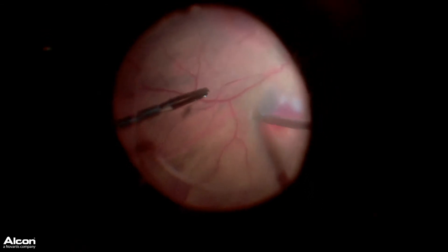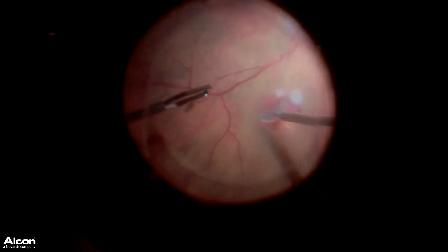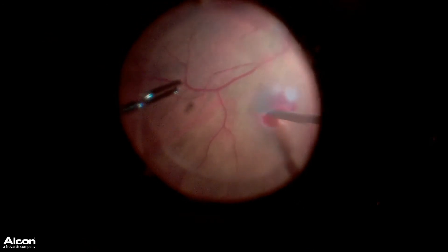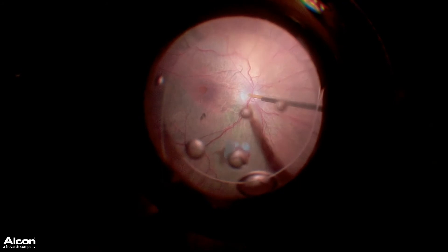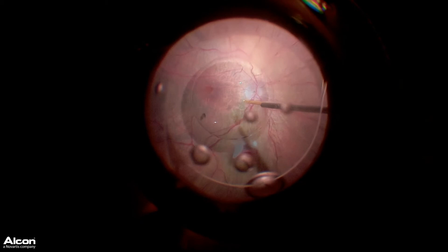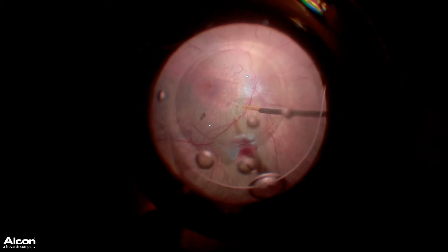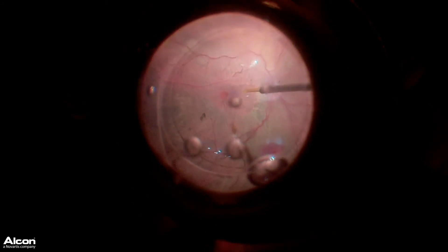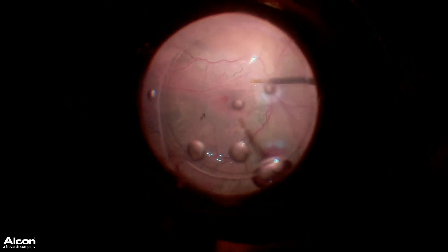I've elevated my pressure in the eye to control that little bit of bleeding. And once we have this flap almost completely cut, we now place PFO — not just over the macula, but over the transplant site. This is important because it helps you to control the retinal transplant.